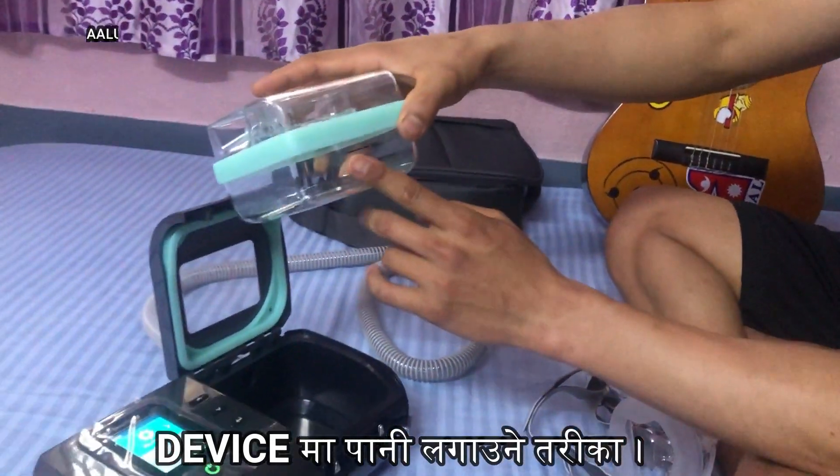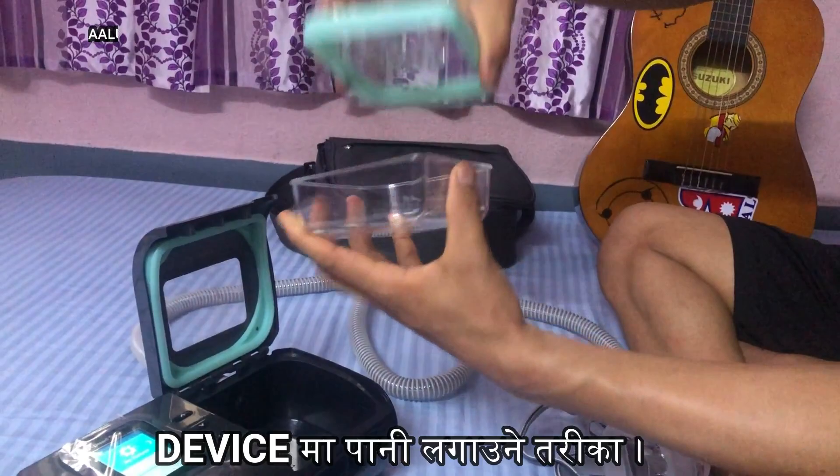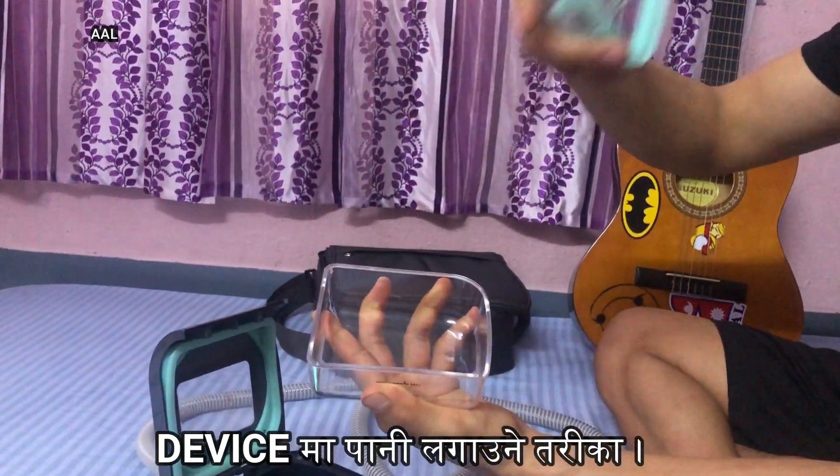You can store the water to the minimum or maximum level as indicated on the chamber.